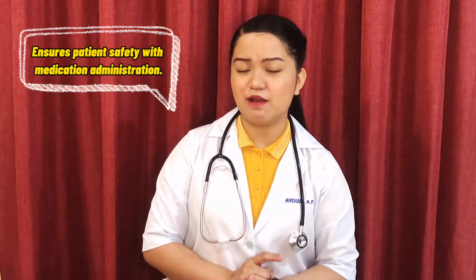Preparing medications ensures patient safety with medication administration.